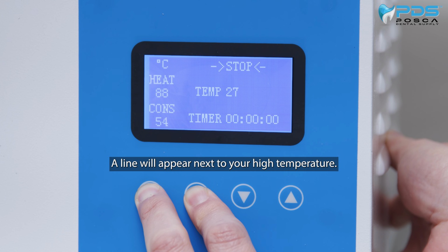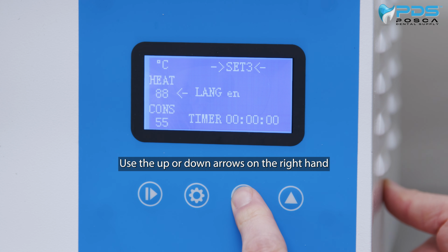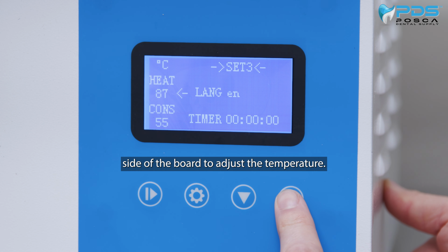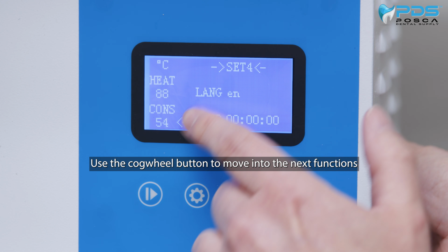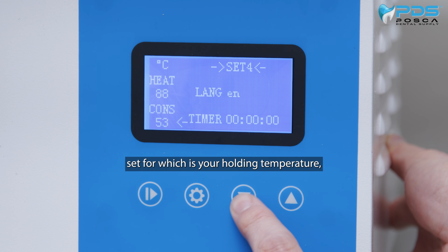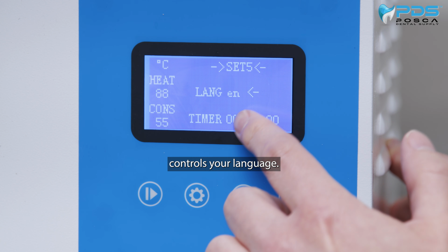A line will appear next to your high temperature. Set 3, use the up or down arrows on the right-hand side of the board to adjust the temperature. Use the cogwheel button to move into the next functions. Set 4, which is your holding temperature, or Set 5, which controls your language.